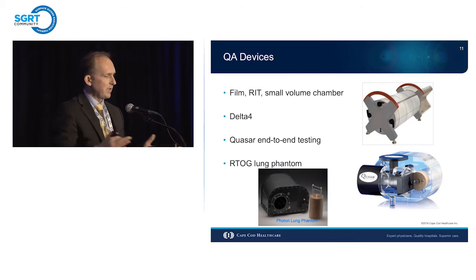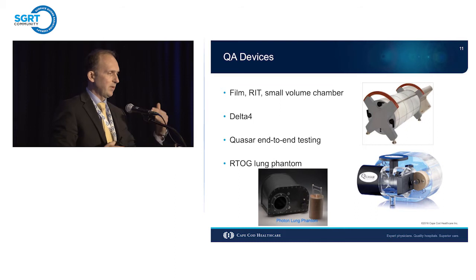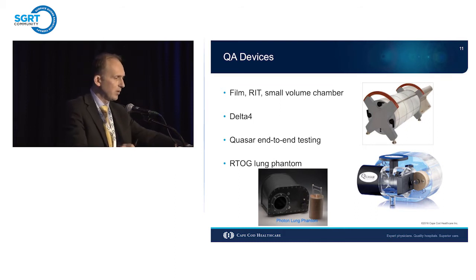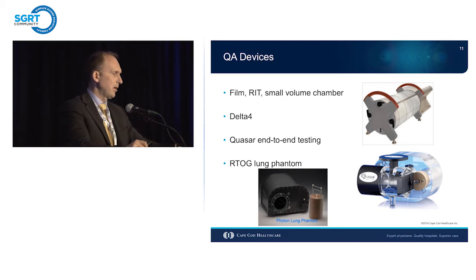So the whole procedure, meaning performing a 4D simulation, monitoring with the gated CT, determining the breathing periods, contouring the tumor volumes on the 4D scan, detecting all those hidden targets, and then delivering the treatment in the same fashion on the machine, can pretty much be covered by a phantom like this. And of course, we did the usual initial RTOG lung phantom irradiation in a 4D fashion to make sure that our program is passing their criteria, and it's independently verified.